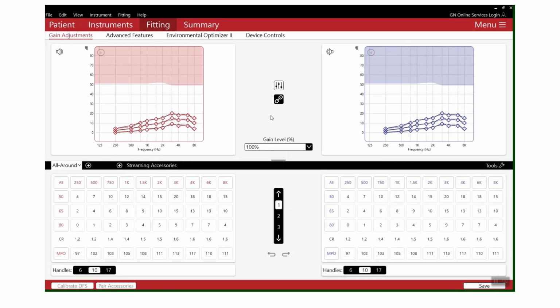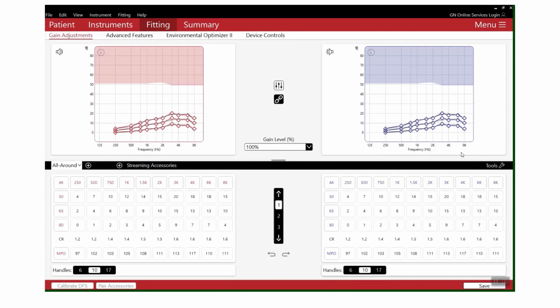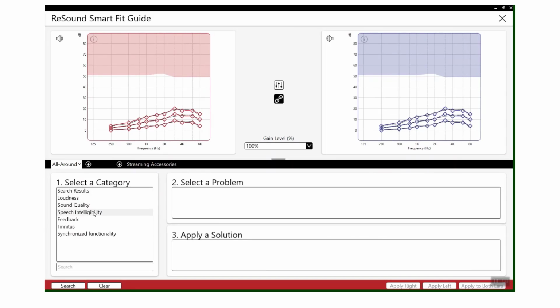Tip number 3, the SmartFit guide. If you're just beginning to fit GN, or maybe you're just a little bit unsure of what adjustment is going to be best for this particular problem that you've been faced with, do not worry. The SmartFit guide will be your perfect little helper. If you go into menu, come down to ReSound SmartFit guide, you will find a catalogue of different issues that you may be faced with, and then some solutions that you can try and apply straight from this screen.